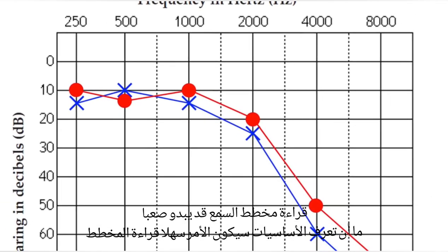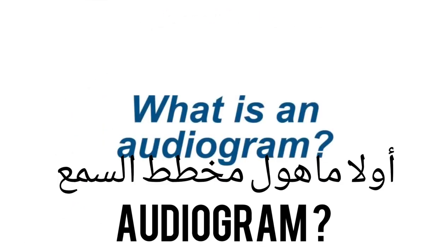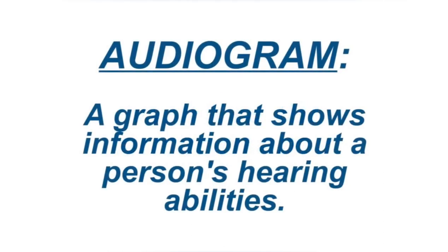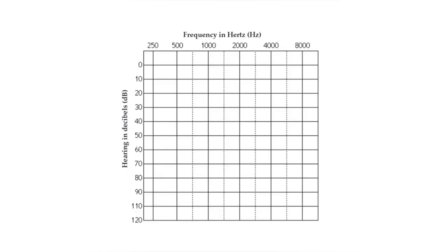Reading an audiogram can seem pretty complex, but once you know the basics, it's really pretty simple. First of all, you may be wondering, what is an audiogram? An audiogram is a graph that shows information about a person's hearing abilities. Let's take a look at the various parts of the audiogram.